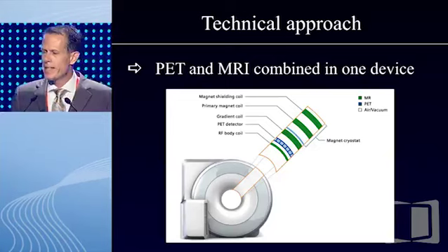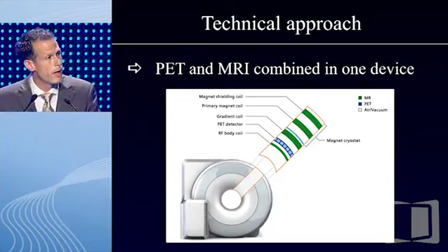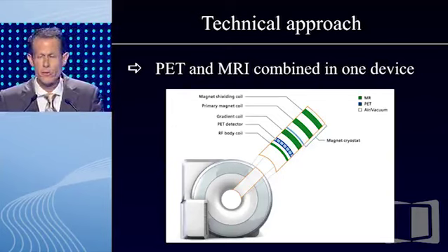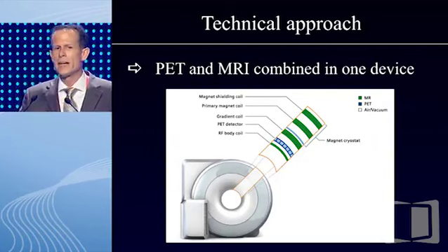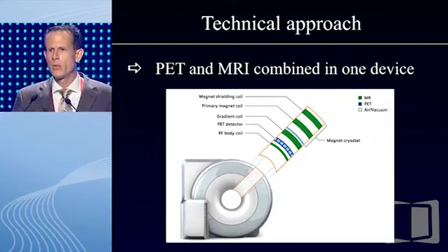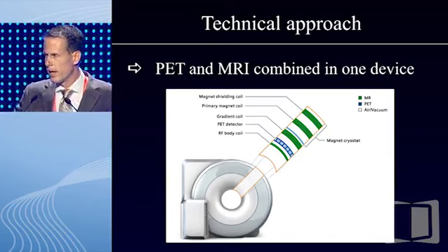And this is the basis that we now use PET MRI. The first PET MR scanners were installed worldwide, I think, in 2011. And this is really nice because you can simultaneously acquire MRI images, morphology, DWI on the one hand, and the PET images on the other hand.